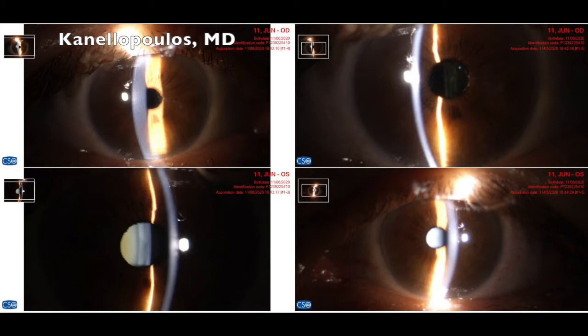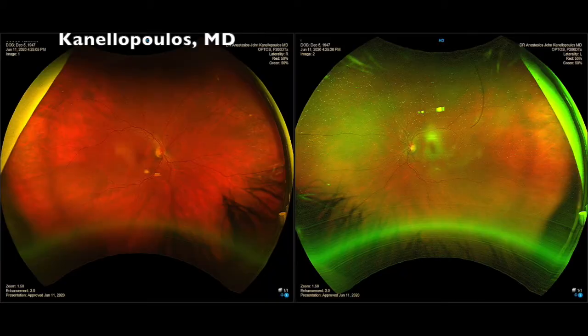This lady is pseudophakic in one eye and has, as you can see here, a significant cataract in her other eye. So the time came to do the second eye — it's her left eye. We're having immersion ultrasound measurements of the actual length to confirm the interferometry.